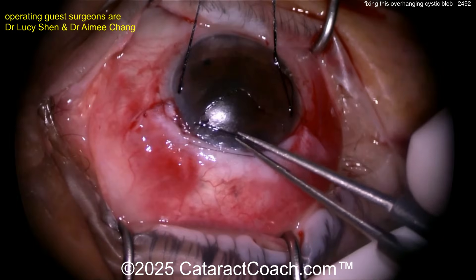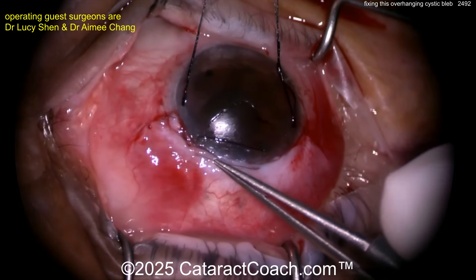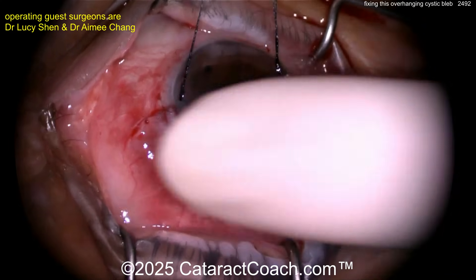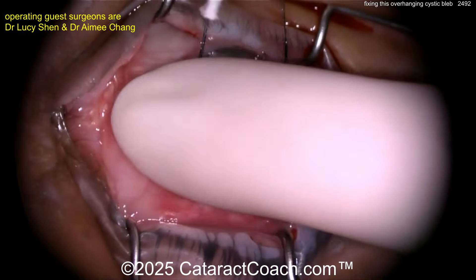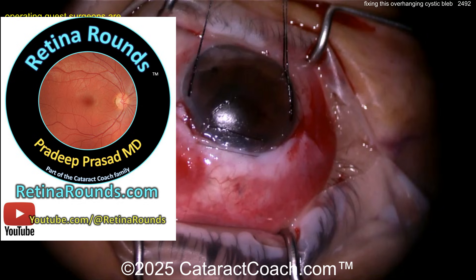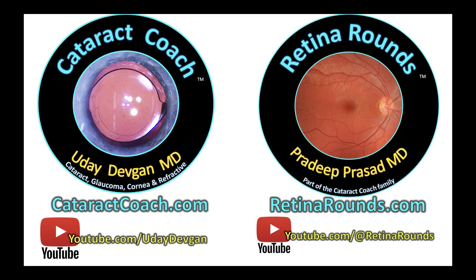Nice and watertight at the very end — check everything to make sure the pressure is good. Interesting choice of horizontal mattress suture; looks great, nice and watertight closure. Post-op month one: looks great, pressure still well controlled, vision's good. Check out CataractCoach.com and RetinaRounds.com for more teaching material.